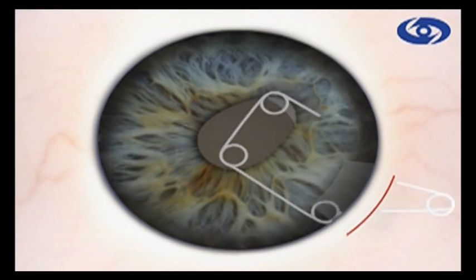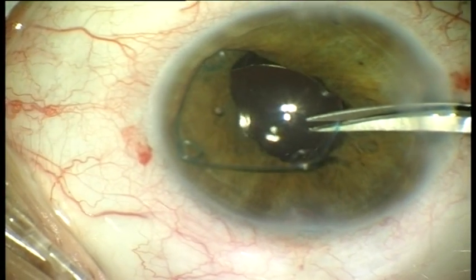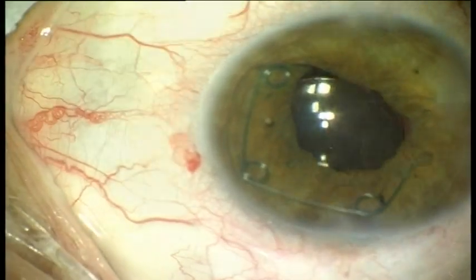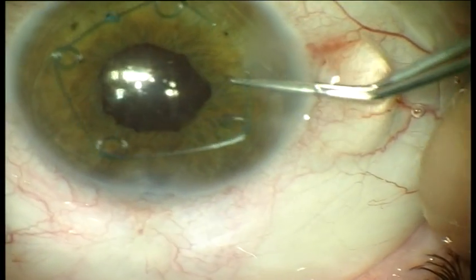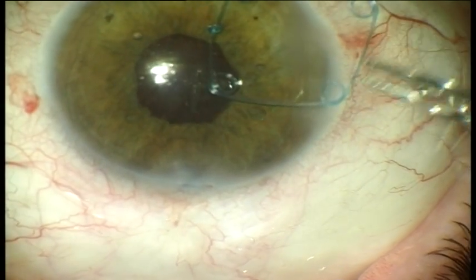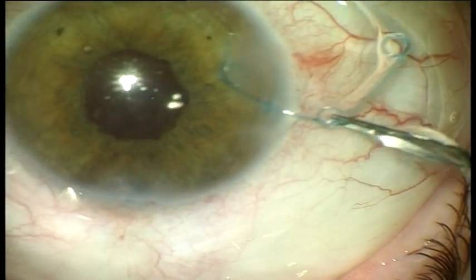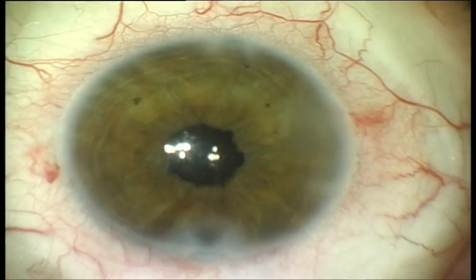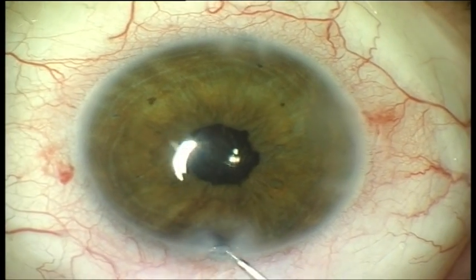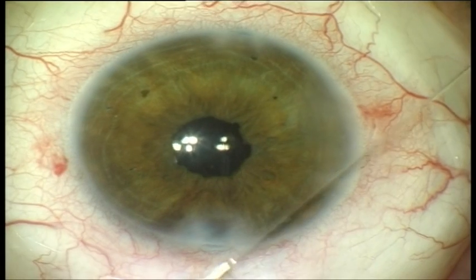At the completion of the procedure, the ring can be removed through the same small incision. After filling the anterior chamber with viscoelastic, we cut the ring with Vannas scissors, then grasp it with forceps and extract it from the eye. As a result, the pupil constricts spontaneously and at the end of the procedure we can see a fine round pupil.